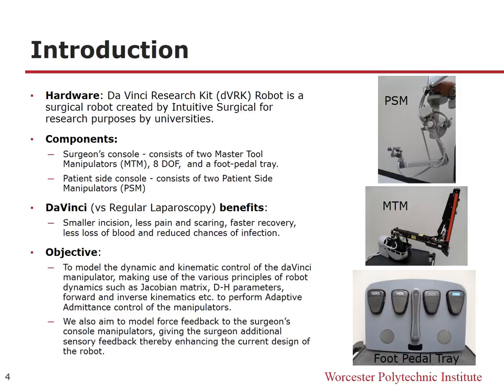This means to exert a constant amount of force on the tissue irrespective of the movement of the tissue or the end effector. We also plan to model the force feedback to the surgeon's console manipulators, thereby giving the additional sensory feedback to the surgeon. This is aimed at making the use of DaVinci robot more intuitive.